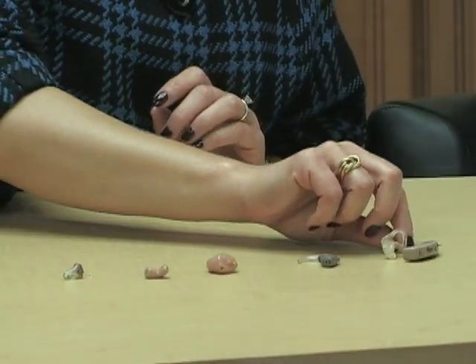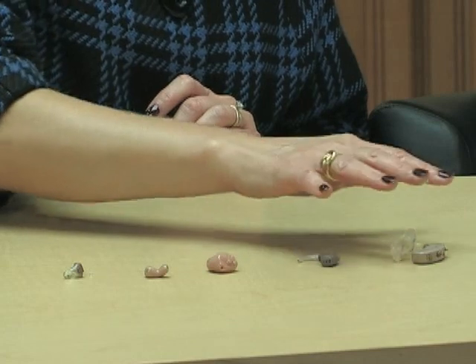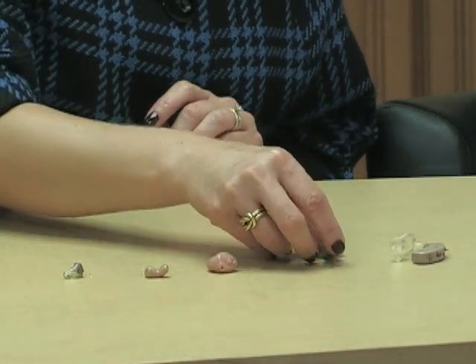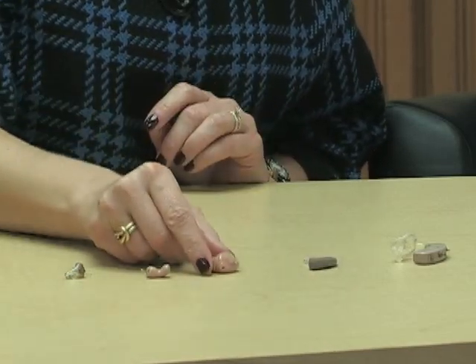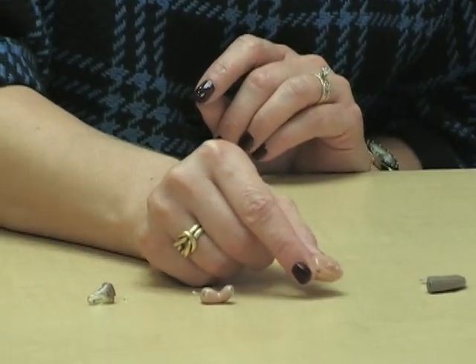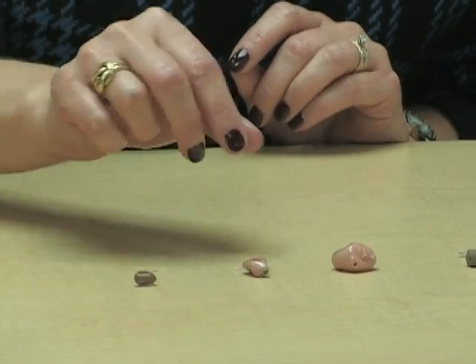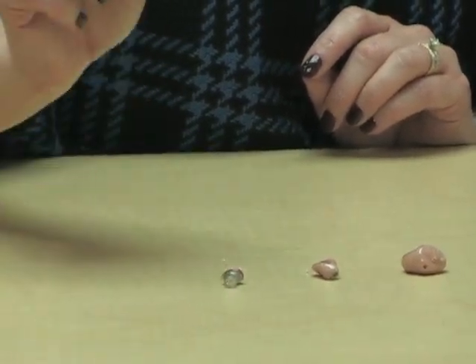This is one of the original behind-the-ear type of devices. Everything is behind the ear. This is our current behind-the-ear device. As you can see, it's a lot smaller. And then we have the half shell that goes down inside the ear canal. And then even smaller is the completely in the canal, or the CIC, and the invisible canal device that's right here.